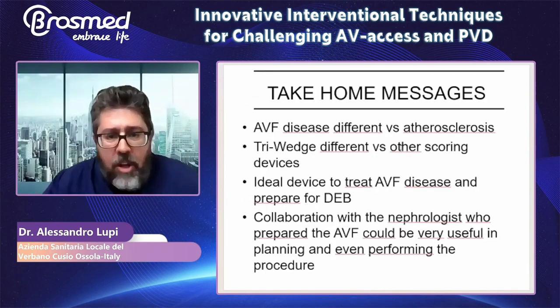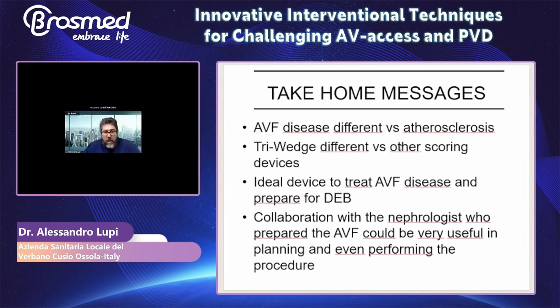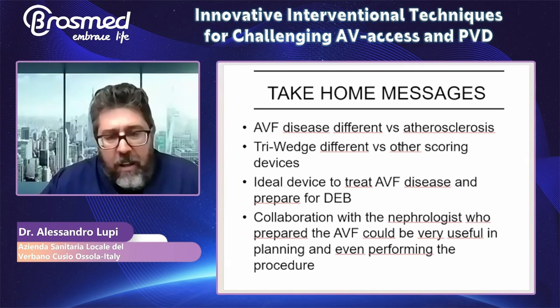So the take-home messages are that arteriovenous fistula disease is very different from native atherosclerosis, and the Tri-wedge balloon is very different from other scoring devices. It is a device well suited to treat arteriovenous fistula disease. It's important to use this device not only to obtain an immediate good result, but also to prepare the vessels for the drug-eluting balloon, which is very useful in this situation.